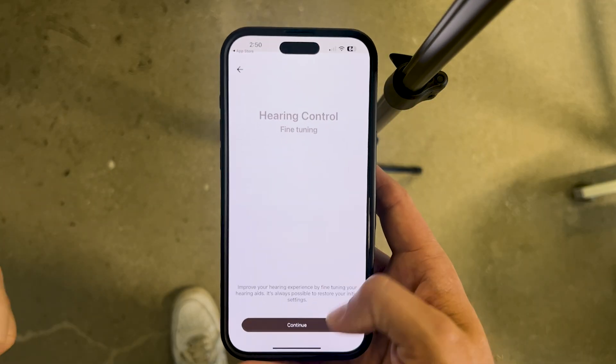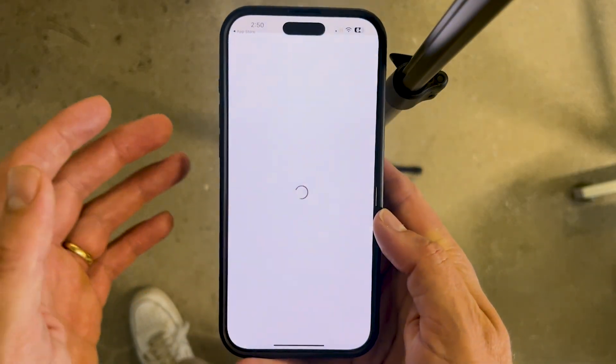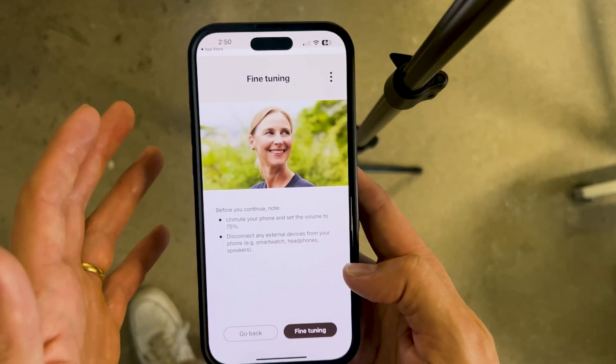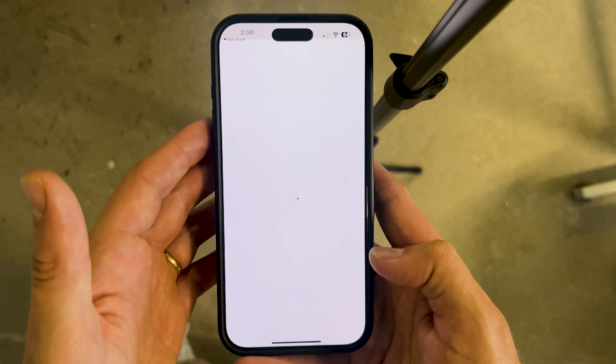The fine-tuning section is one of the main things folks do not realize is available. It's kind of hidden in the menu, but once you get into it, you're going to have a ton of controls that will enable you to make lots of changes to your hearing aids. Let's head into the fine-tuning section and I'll show you what's inside.